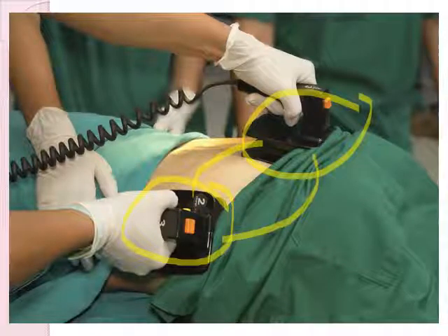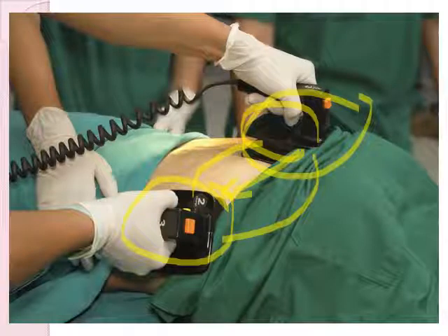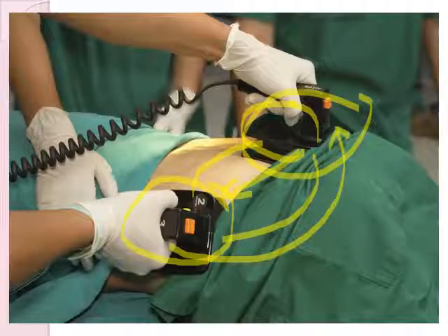Now, you have two different kinds of defibrillators. You would have a monophasic and a biphasic defibrillator. Okay, common right now is the use of your biphasic defibrillator. So when I say monophasic defibrillator, the current or electricity travels from one pad to another. That alone. When I say biphasic defibrillator, the electricity travels from this pad going to this pad, and then from this pad going to this pad. Hence, it's referred to as biphasic because the direction of the electrical flow is two-way.